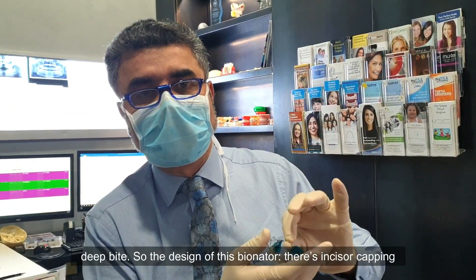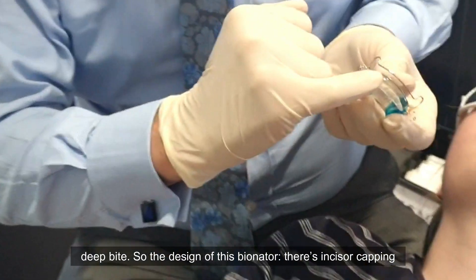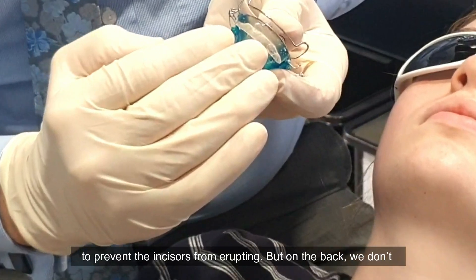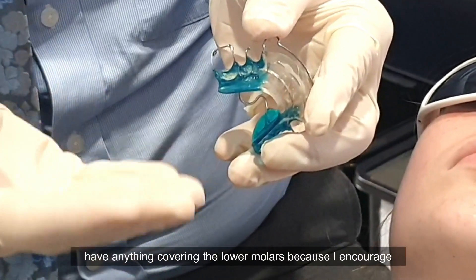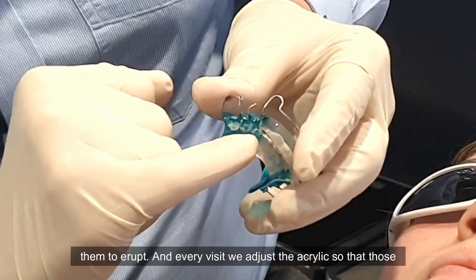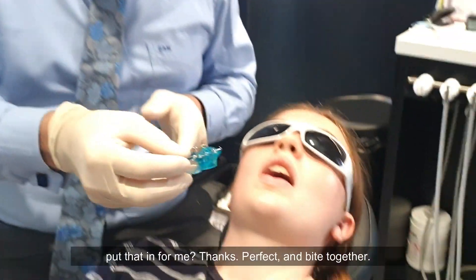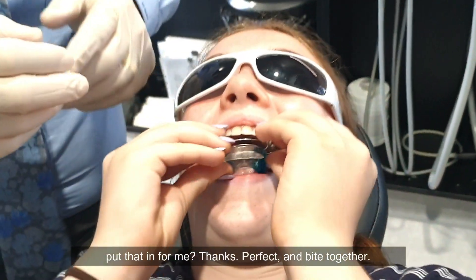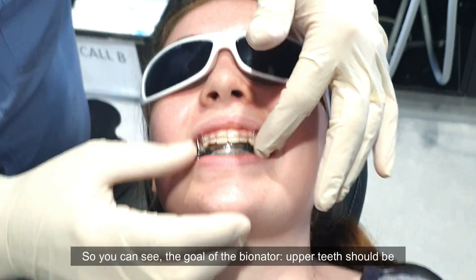The bionator to open is designed to continue opening the deep bite. There's incisal capping to prevent the incisors from erupting, but on the back we don't have anything covering the lower molars, because I encourage them to erupt. At every visit we adjust the acrylic so that those molars continue to erupt in a class one position.